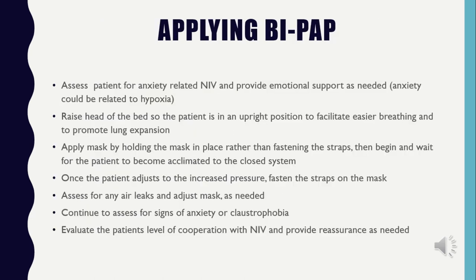Okay, so for applying the BiPAP machine, you want to assess a patient for any anxiety and offer emotional support as needed. Also, something to consider is that this anxiety could be related to hypoxia. So we always want to consider that and continue to reassure them that we are going to find the answer and solution to their shortness of breath or anxiety. We want to raise the head of the bed, so that way we can allow for full lung expansion.